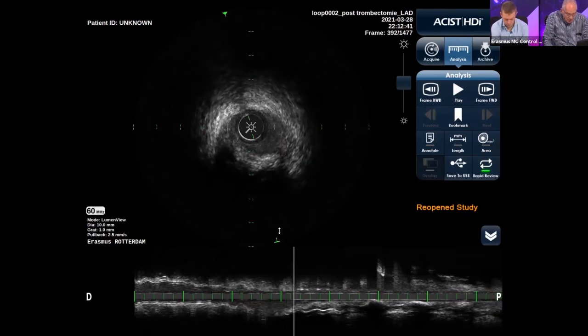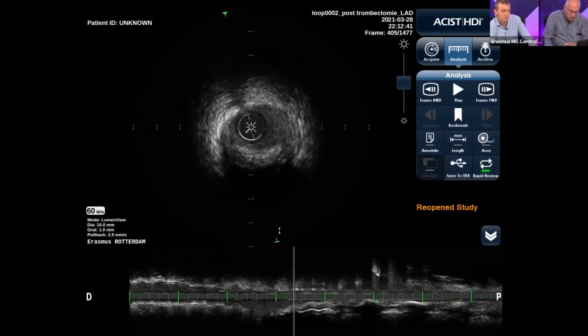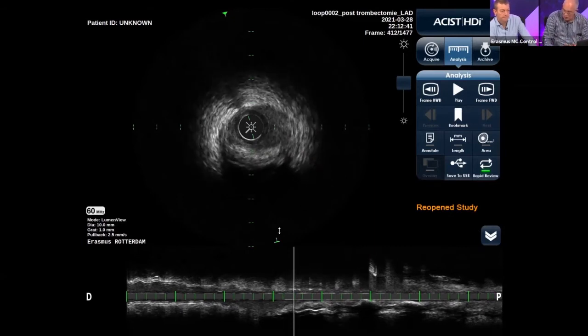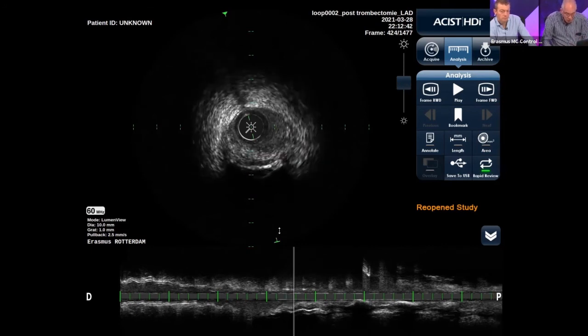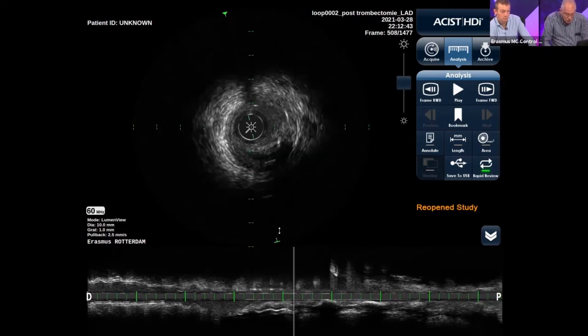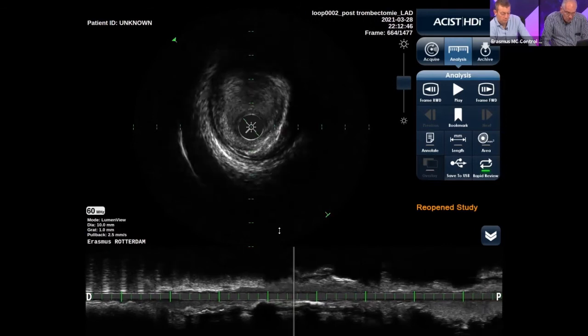Now that is actually what we also want to emphasize in there. You saw we did an IVUS in the thrombus in there, and you saw that we didn't make any attempts at making measurements. It's no use because you're going to do the thrombectomy, but you're also going to do a pre-dilatation, which may also cause dissections, and you want to take the length of dissection into account with your sizing for your stent. So it's no use to measure before you do a pre-dilatation.